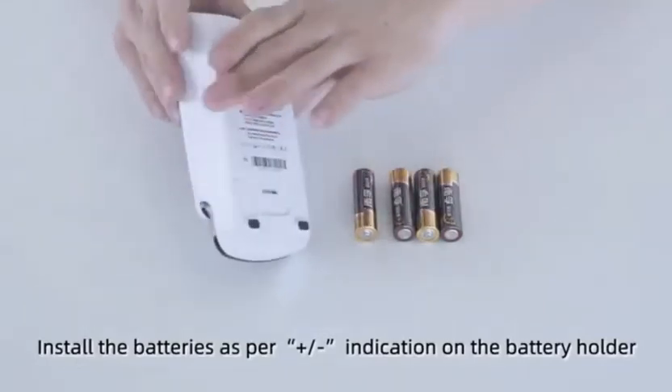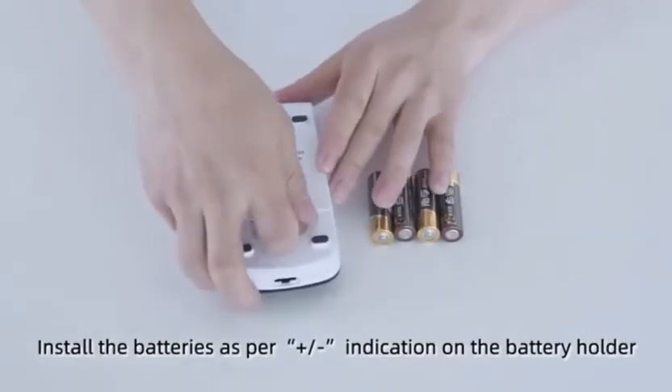Install the batteries as per the positive or negative indication on the battery holder.